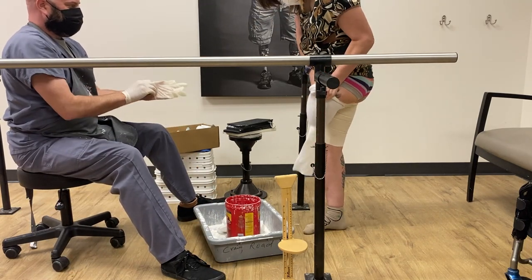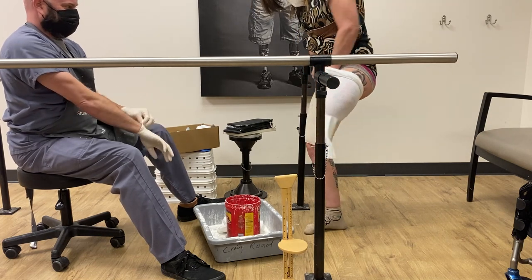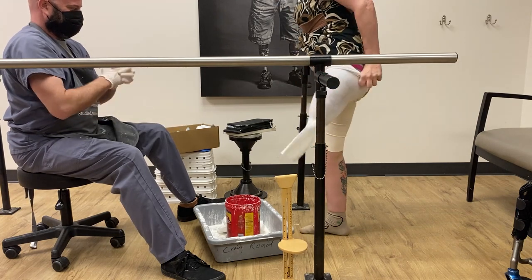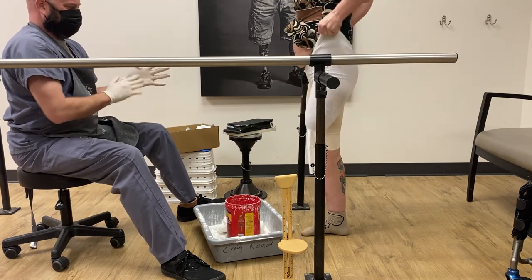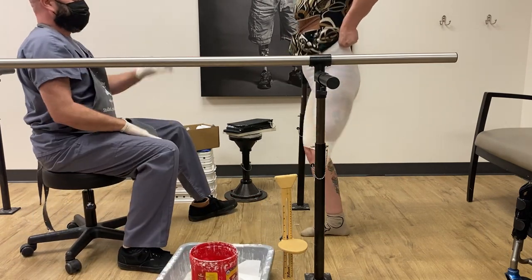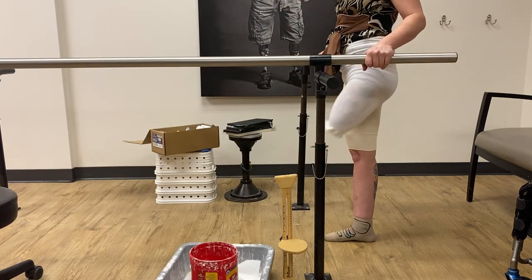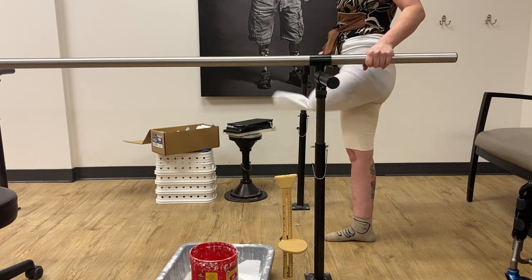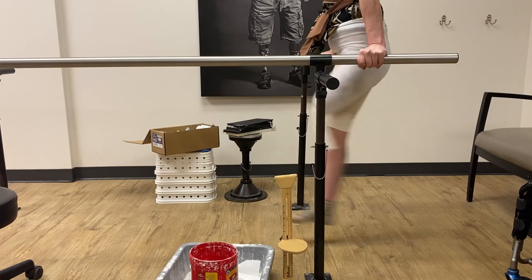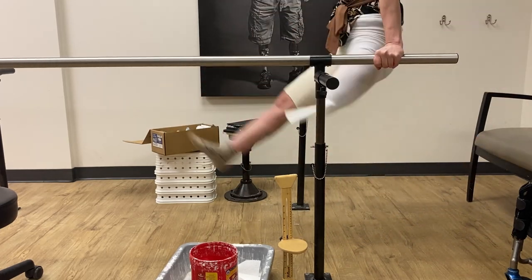My scar there is a little sensitive to stuff rubbing on it — and that's apparently where we're gonna put all the pressure. My prosthetist and I have known each other for years, and so clearly we've got a very sarcastic rapport going between each other.